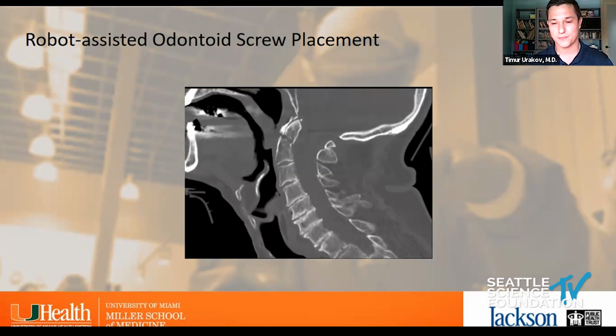pedicle orientation. Now, we take the technology as something that's rigid, tubular, and you can align it with any line in space that you can draw. So why not start drawing lines everywhere else that we may use it? Here's a typical case.